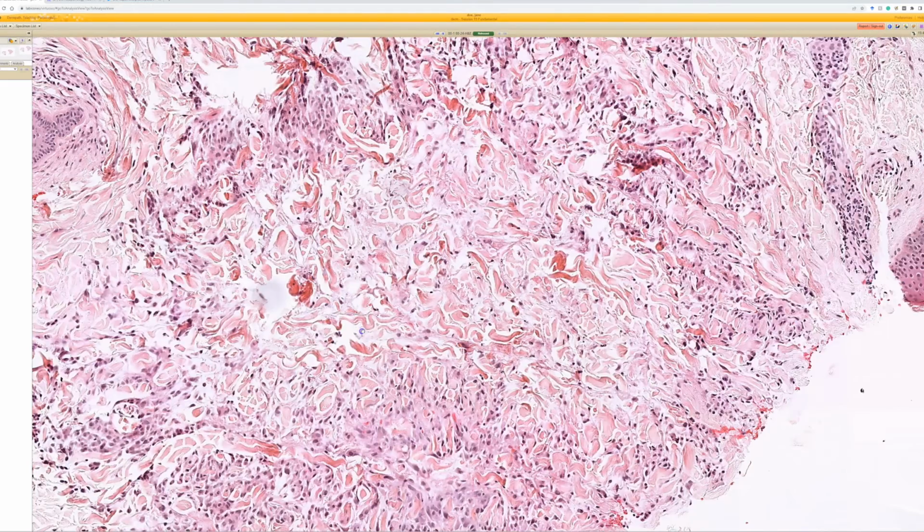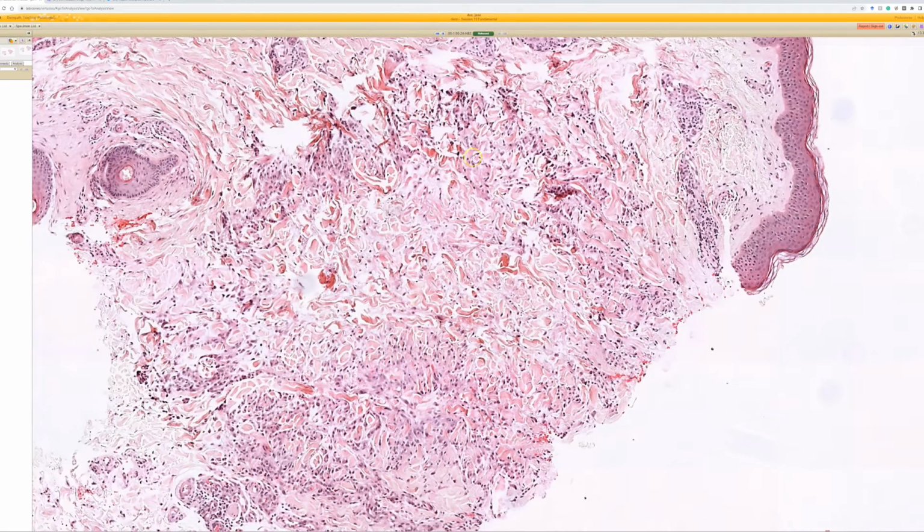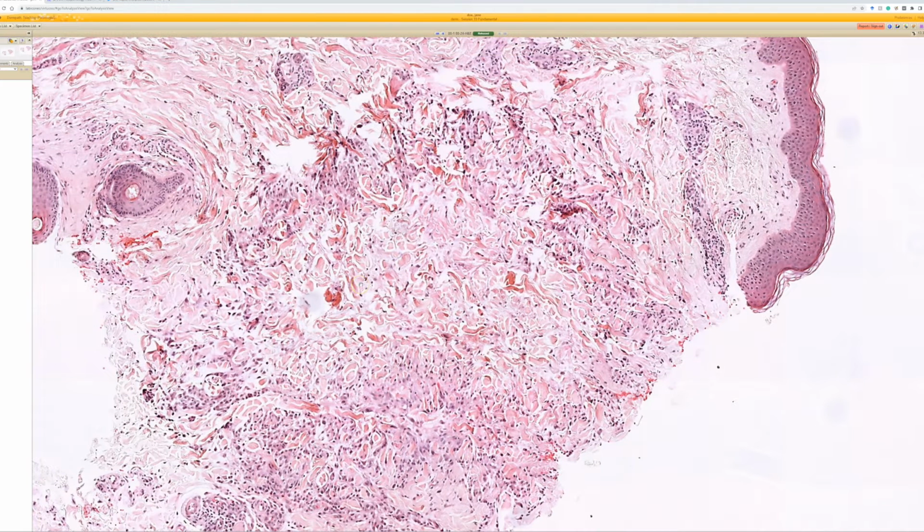This is the perfect classic feature of Granuloma annulare, which is an idiopathic granulomatous process. And the word annular is from the Latin for a ring. And it's kind of cool because it is both ring-shaped microscopically in most cases. Sometimes it's kind of a vague, subtle ring, but you can kind of see a ring of histiocytes wrapping around this central necrobiosis. But it's also ring-shaped clinically. It looks like an annular ring-shaped lesion, kind of with a raised edge and a flat or maybe slightly depressed center, depending on the case.